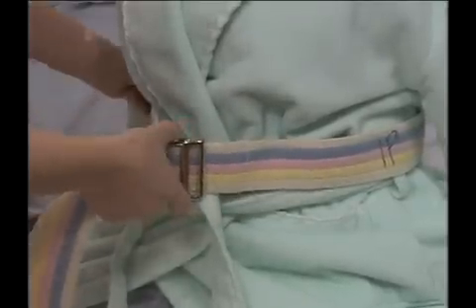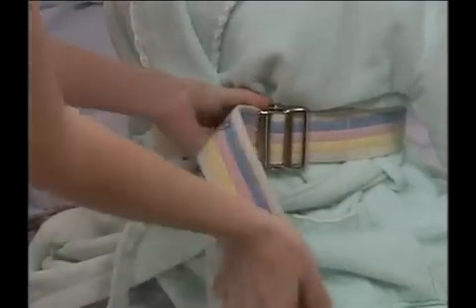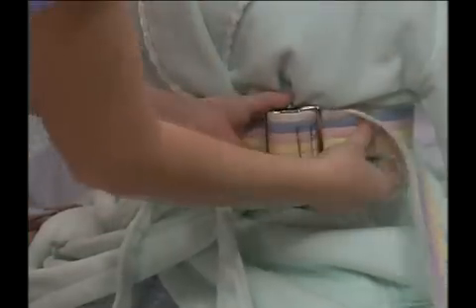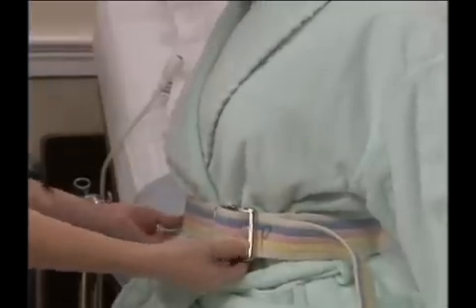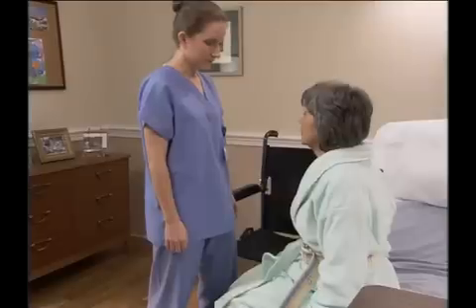Before you tighten the belt, turn it so the buckle is off-center, perhaps even off to the side. Tighten the belt and check for fit. It should be snug, but you should be able to slip your fingers between it and the person's waist. If you're putting the belt on a woman, make sure you do not trap her breasts beneath the belt. Next, assist the person to the place she is going, in this example, to her wheelchair.